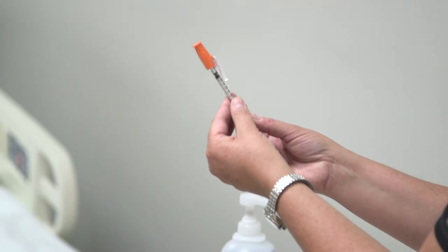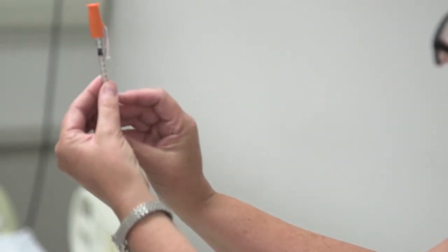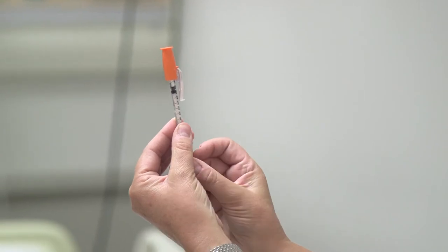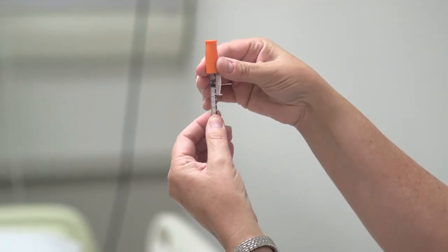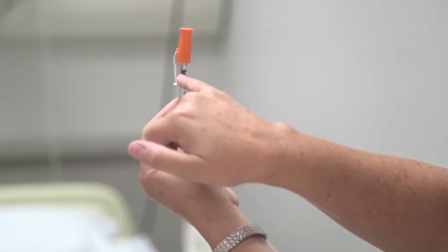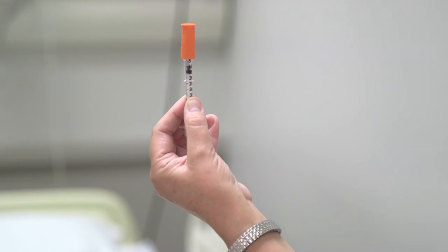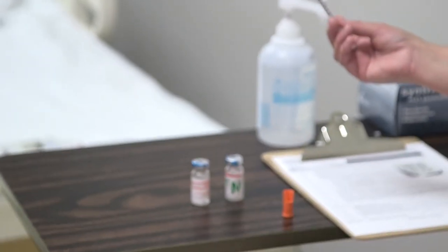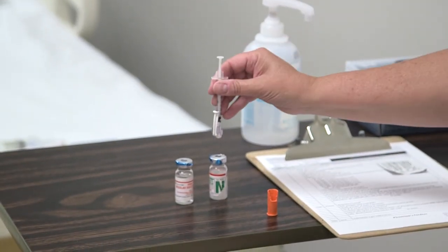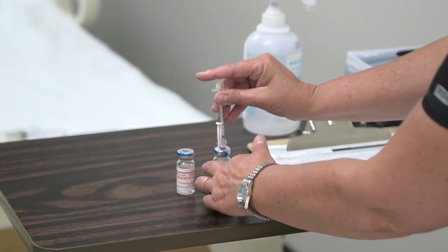To begin with the NPH, I'm giving 10 units. The top of the plunger is right on the 10-unit mark — that's how much NPH air I'm going to inject. You can take the top off; this syringe is nifty because you can set the cap right there to avoid cross-contamination. Go ahead and inject those 10 units of air into the NPH vial.